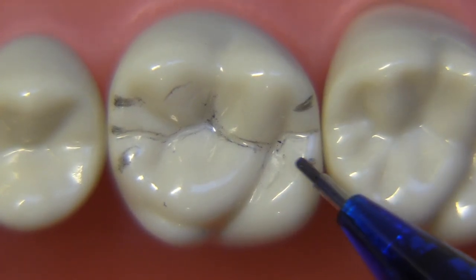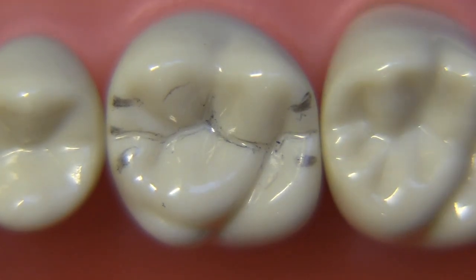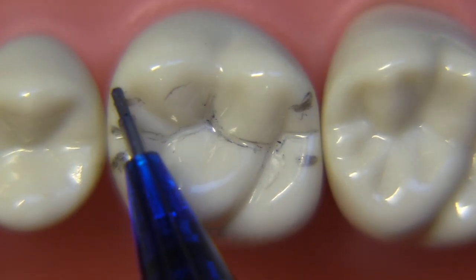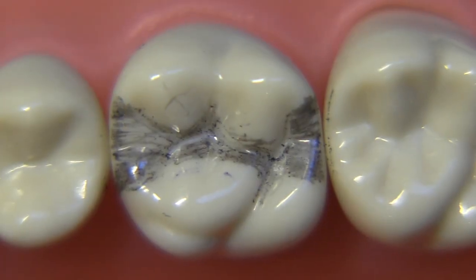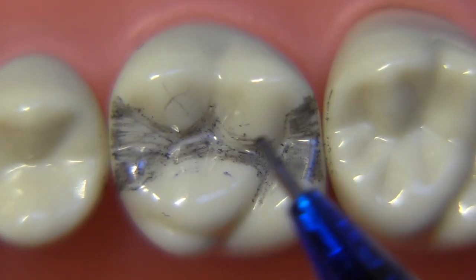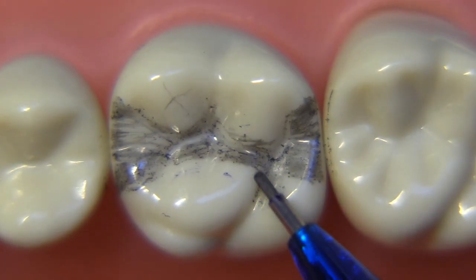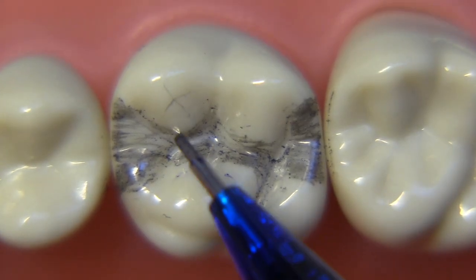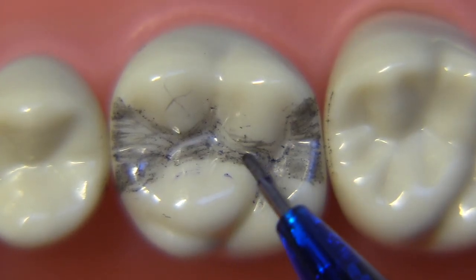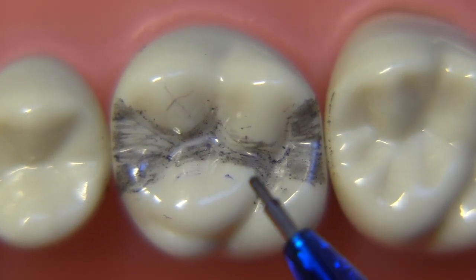I'd like to think about how far the boxes are going to have to be extended buccal-lingually to achieve clearance. I'm going to go ahead and show you what this tooth would look like after I've filled it in, to give you an idea of the outline form. There is going to be a tricky area between the distal lingual groove and the distal box, and you'll get to see how we work that out in the final preparation.